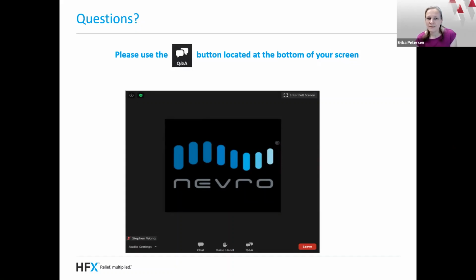Part of that's because we don't really know exactly all of the different pathways that are being changed with the stimulator. If you have a lot of buzzing or pins and needles, tingling, itching pain in your feet, and you can actually get some quiet, it's kind of like being in a loud restaurant where the band is going and there's music and everything, and all of a sudden the band's quiet and you can actually hear the conversation at your table. Think about if all that buzzing and tingling was able to be turned down, and now you can actually hear the quiet amount of sensation that's still there. So I think some people during the temporary trial realize they have more sensation left than they thought, because some of the pain noise has been tuned down. Some other people may not have noticed that, but we potentially see a longer term change, and we're not sure exactly what causes that yet. We're seeing some additional research being done to figure out those explanations. Great, thank you.